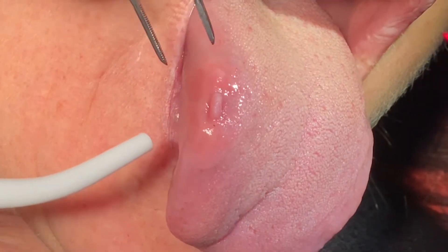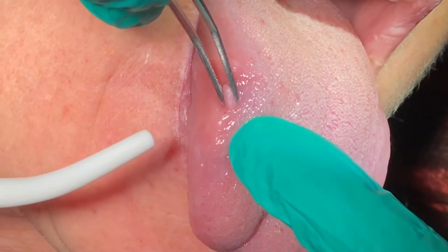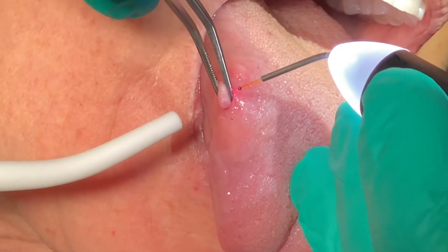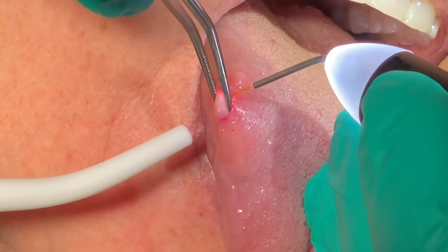We're going to do a fibroma excision right here on the tongue using the Evo at 1 watt. The tricky part is grabbing it — once you grab it, it usually goes pretty quickly. The patient is anesthetized with one little drop of septicane.